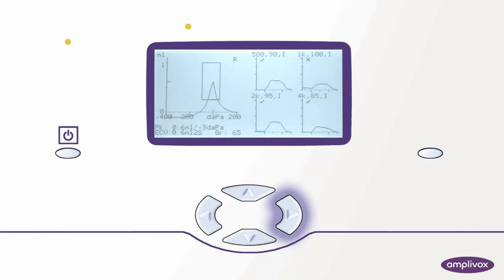Selecting the right key will bring us to an overview showing the ipsilateral reflex outcome for all four frequencies. Selecting the right button again will show the reflex curves individually and in detail.